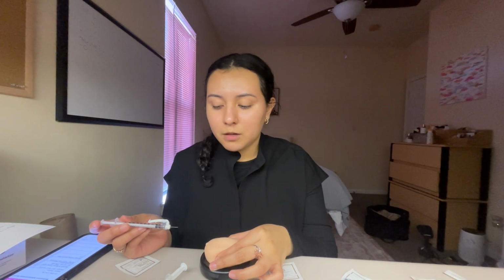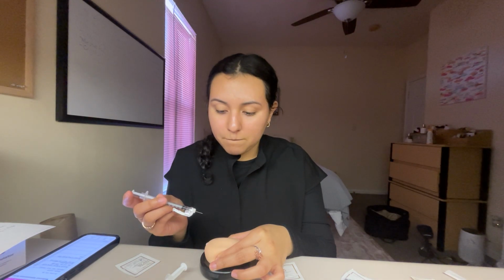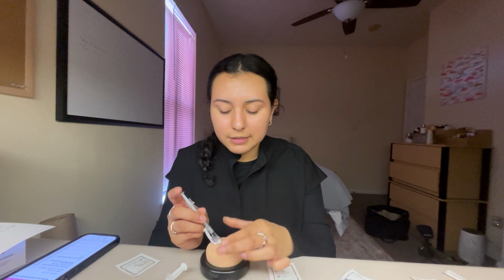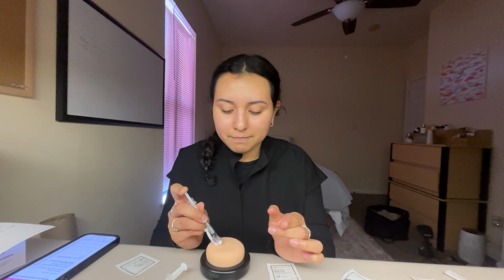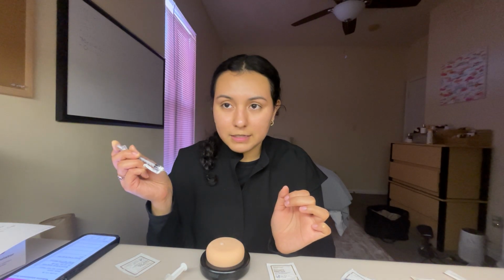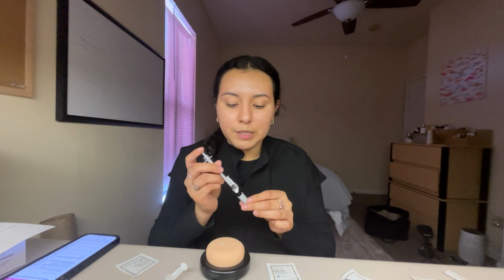This time we're going to pinch it at the injection site. Okay, what we're going to do, bevel side up, and then insert. Then we're going to release the skin, and we're going to slowly administer our medicine. Then we're going to remove it the same way that we inserted it. Again, I would safety gear it and then put it in the sharps disposal.